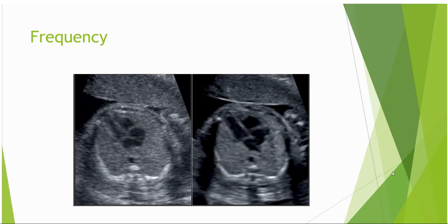Be aware that harmonic imaging increases the spatial pulse length and can make structures appear thicker. This may be of importance when assessing intimal wall thickness or valve leaflet thickness. If the image quality permits, in some instances it may be beneficial to turn off this feature for comparison and then just image with native frequency.